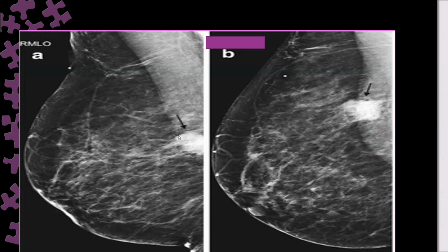It is posterior. Okay, it is really posterior. I could see the lesion well, but I could not see its posterior end. But when I go to the extended lateral view, pulling the pectoralis, I could see the posterior portion of it. I could not with a straight lateral view; this posterior part will be cut.